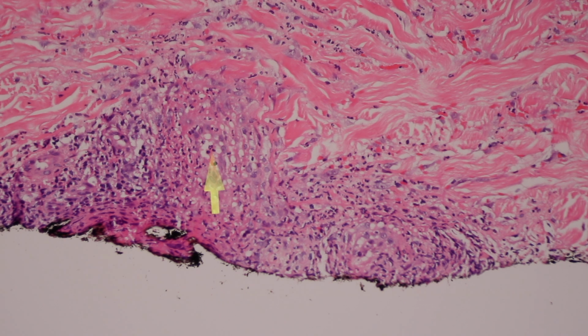Now, there are some systemic clotting processes and thrombotic and other vaso-occlusive processes that can have fibrin thrombi filling up the vessel, as well as leukocytoclastic vasculitis. So it's always good to keep that in mind and consider doing coag workup clinically, as well as other systemic rheumatologic serology tests that you need to exclude a systemic process.